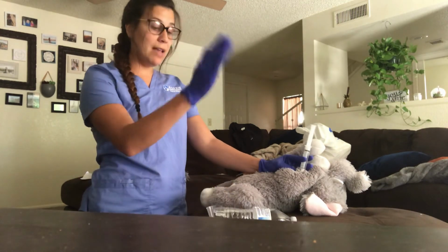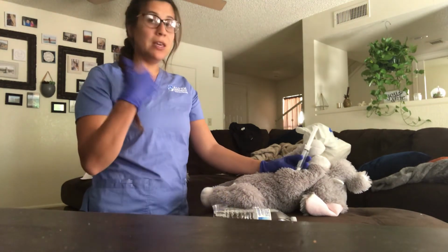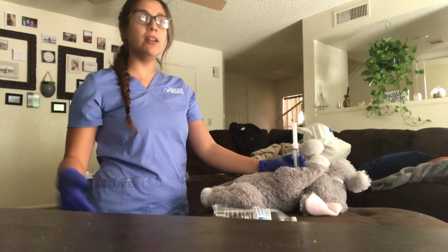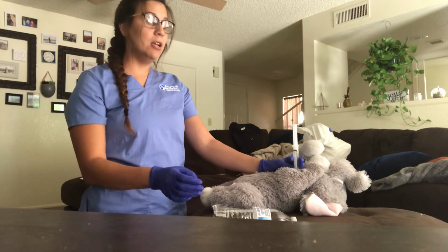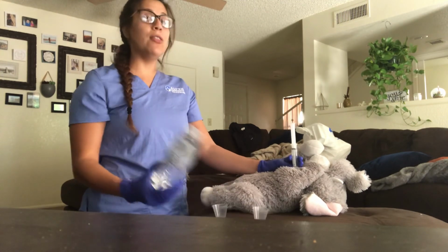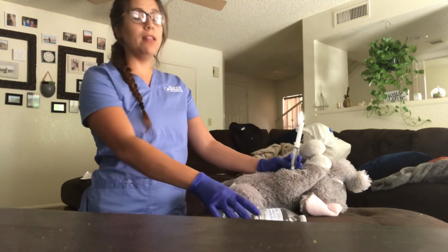And then once that goes down, you would go ahead and give the next medication. You keep doing that process over and over for each medication. Once they're done with all of their medications, you're going to go ahead and flush the tube for the last time, and it's going to be about 30 milliliters of water. So you would flush it for the last time.